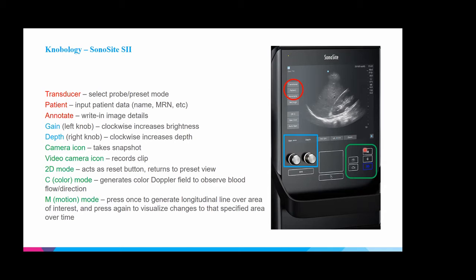We can look at it for lung sliding. So M actually stands for motion, but you can use it for creating a midline, a line in the middle, but you just have to make sure no one has used it or adjusted the ultrasound machine before you. So this is going to be the most common things you're going to use and adjust on the Sonosite.